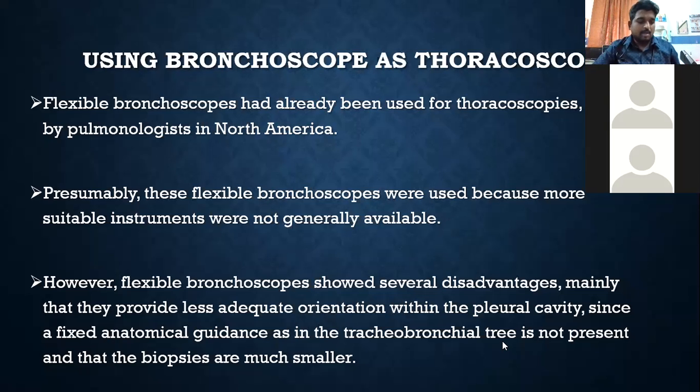Whether we can do the procedure with a bronchoscope, because most of the time, this semi-rigid thoracoscope costs a huge amount. So that's why we used to prefer a rigid thoracoscope, because it costs only 2 to 3 lakhs with all the accessories. But one thing is that rigid gives a feel like a surgeon. So most of the time, new interventional pulmonologists feel somewhat reluctant to use rigid instruments. But of course, both are simple, both are easy. So can we use a bronchoscope as a thoracoscope?